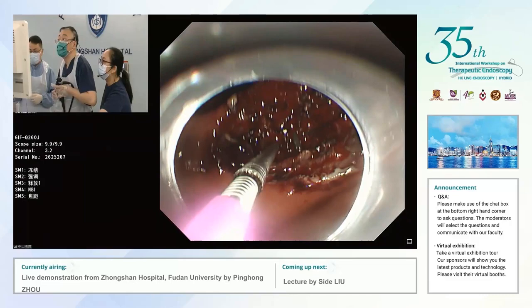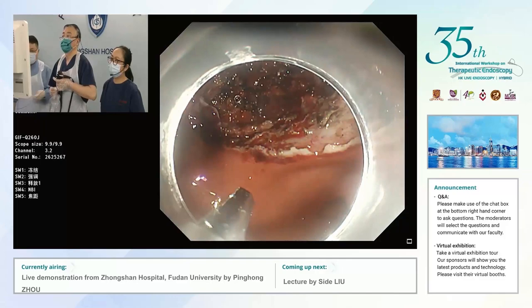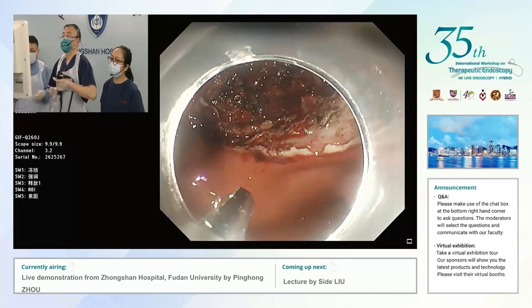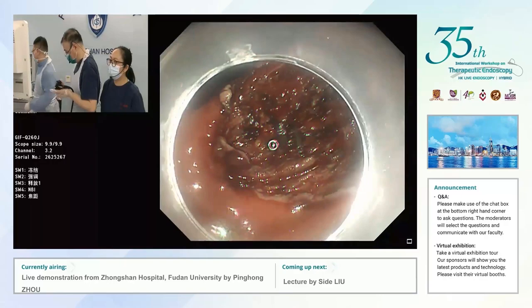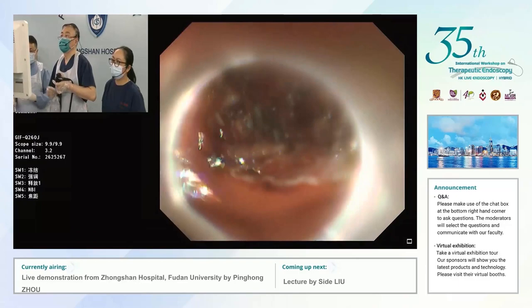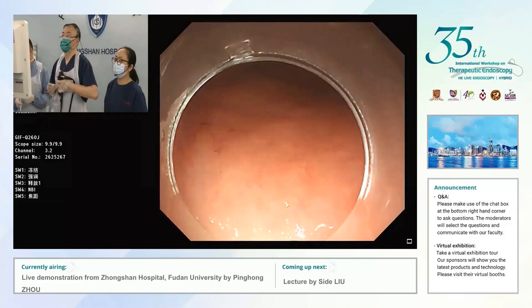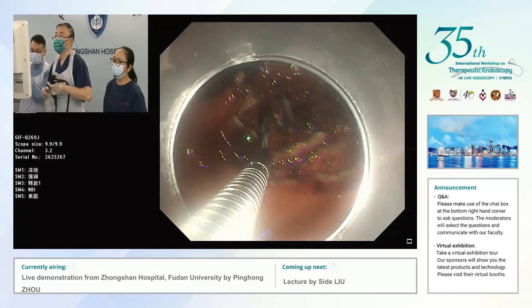This is somewhat different, of course. This is a subcserosal artery, so it could be anywhere between two to three millimeters. Ovesco would be good, but it's quite costly. Looking at Professor Zhou — he had a very good view of the artery. I would prefer clipping instead of coagulation because sometimes coagulation is unpredictable; when bleeding starts it takes away your view. But I don't think it's a problem for Professor Zhou — his heart rate would never raise even in the presence of such bleeding.